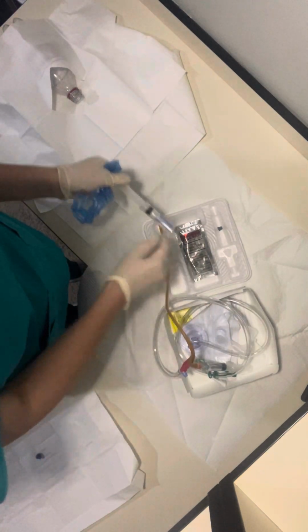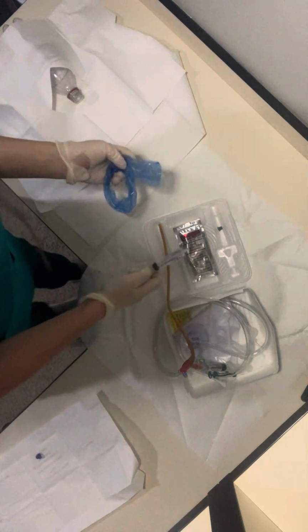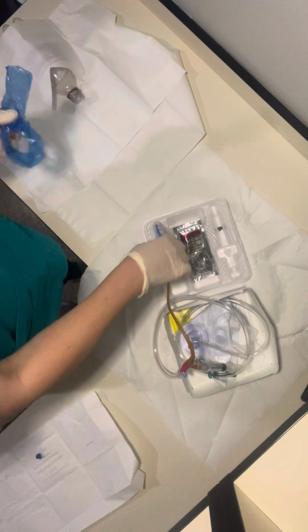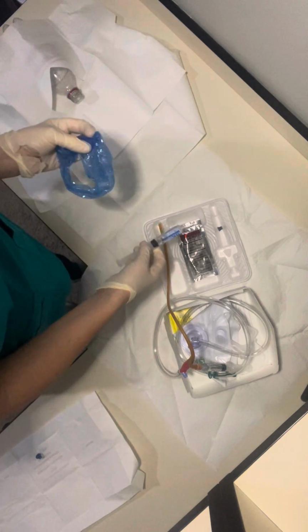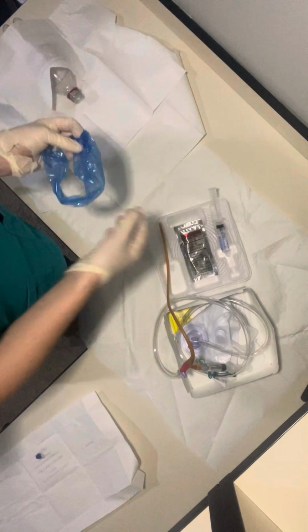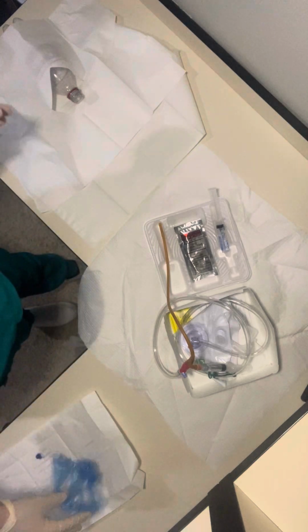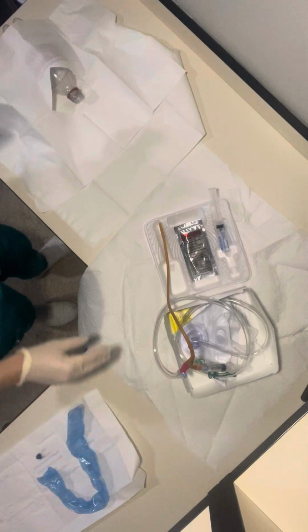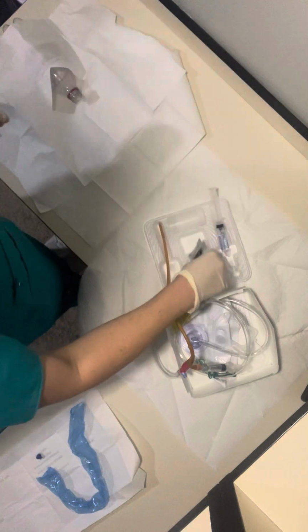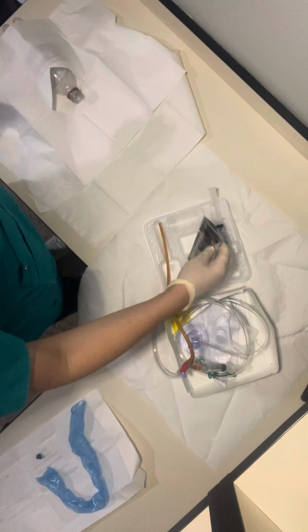Let me remove this. Okay, so once this is in the gel, then I'll just place it there, and this can go here. And I wouldn't go across my sterile field. I would always go out and around my sterile field. Okay, and then the swabs, and then I'm going to go out.